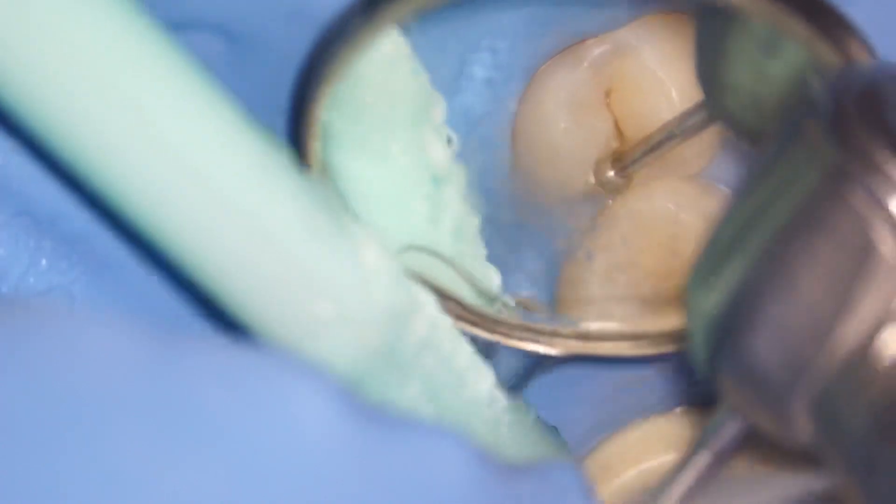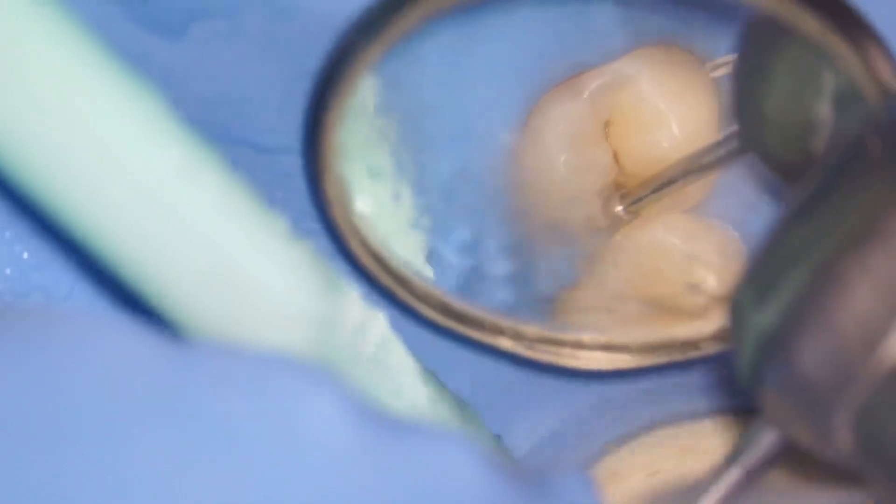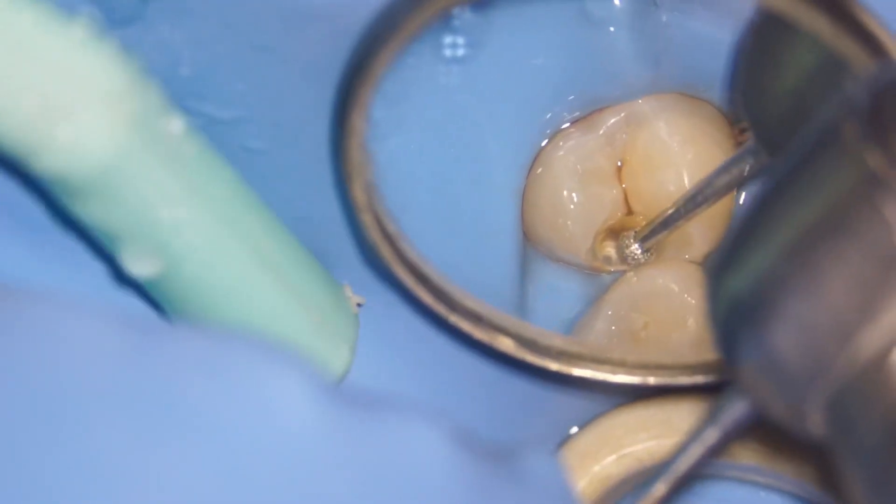Although we've been doing caries excavation for years, sometimes caries like this do surprise us. Look at that — you can already see how deep the caries is going to be.